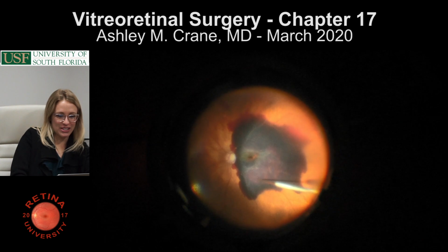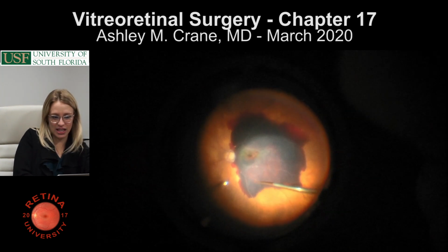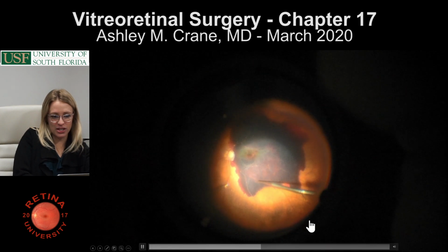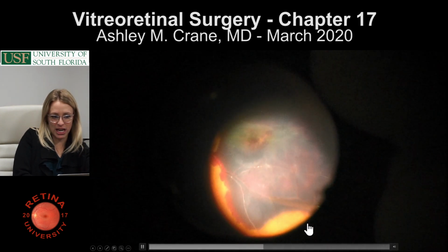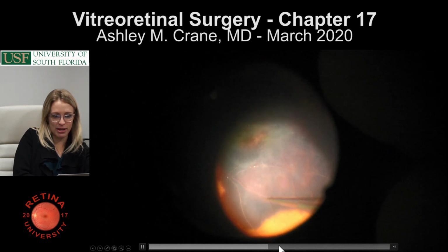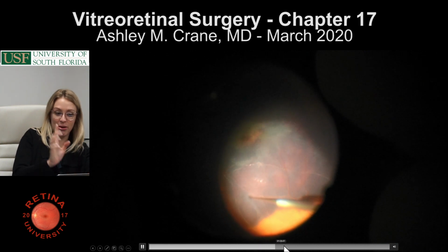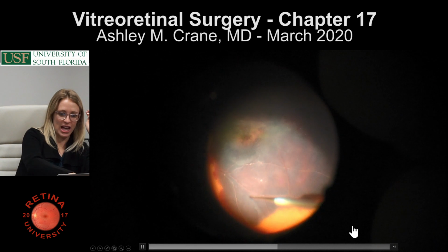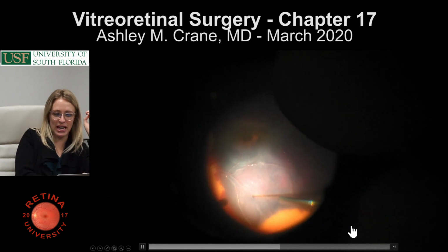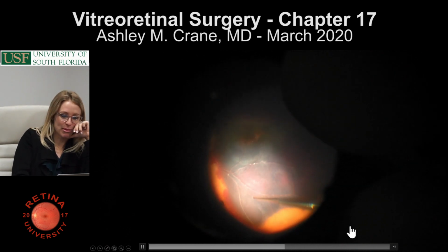So then you'll make a retinotomy with this cannula, and then start injecting the medication, and you'll try to make a bleb. Okay, the retinotomy is there. That's cool. I was supervised at this point, and I'm sure my attending was saying, "Stop bending the needle, keep the needle straight." I can hear him in my head.